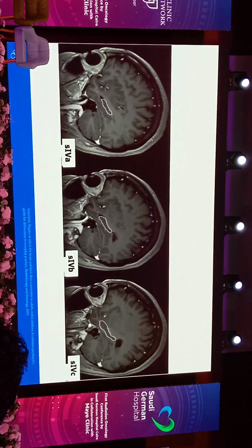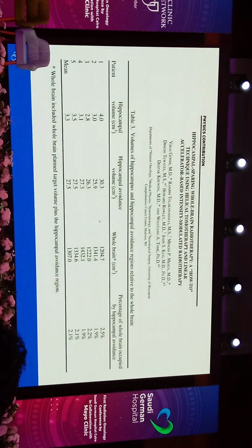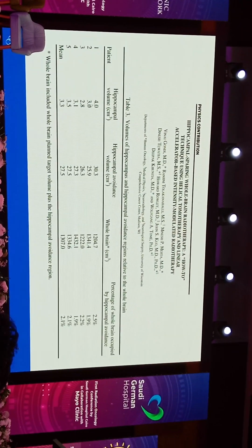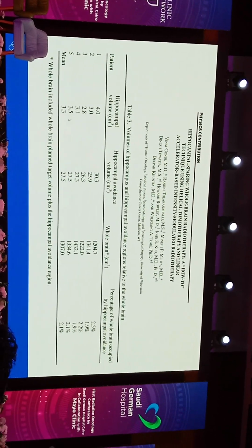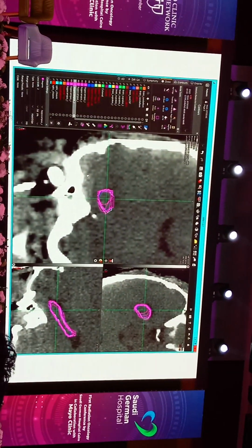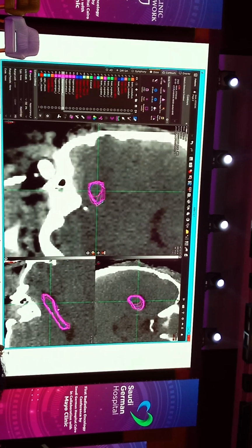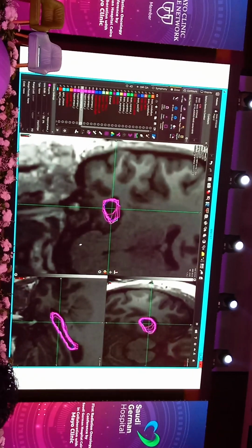for understanding outcomes. Thankfully, we have great consensus guidelines, as mentioned, for things like the hippocampi, and this has been done prospectively, multi-institutionally, but nevertheless, for a structure that's 3 to 4 cc's, significant variation in human delineation is there. And we see that. These are multiple observers at our institution contouring out the hippocampus. And you can see while the staple definition likely has good agreement on what would anatomically be the hippocampus, that there's a decent amount of variation.